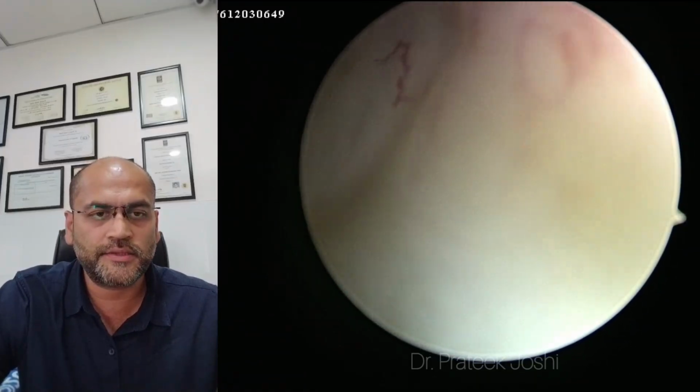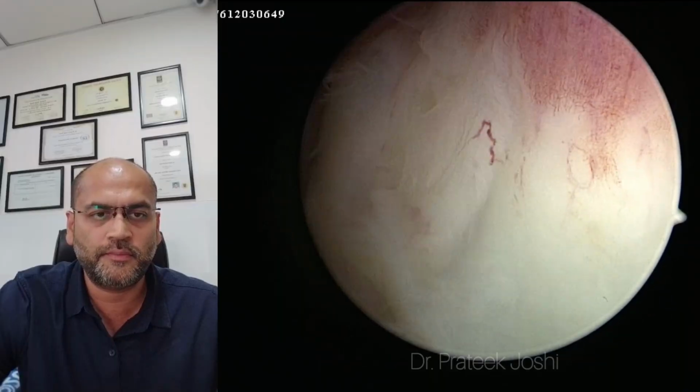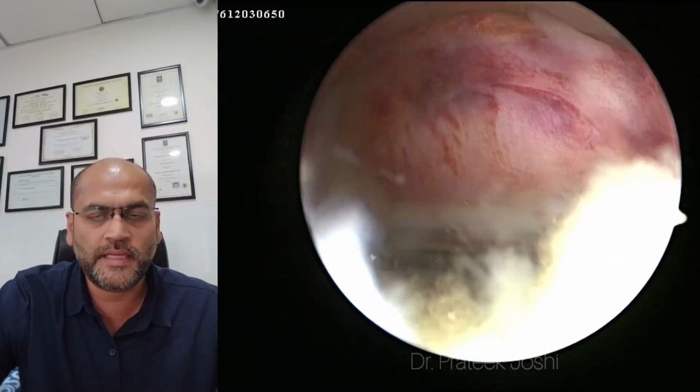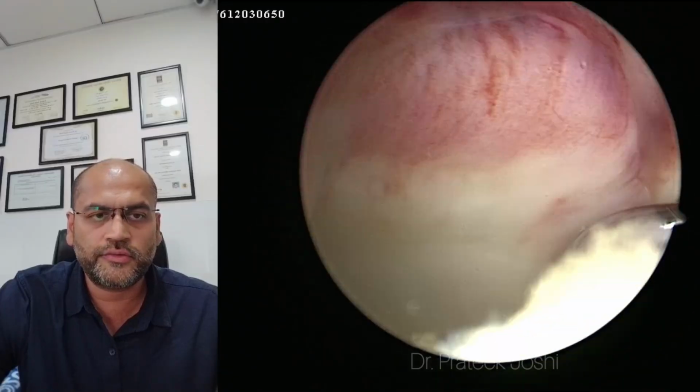Today we have a case of a young gentleman who sustained a twisting injury to his right knee joint 1 month back. He was found to have a complete ACL tear on MRI and on diagnostic arthroscopy.